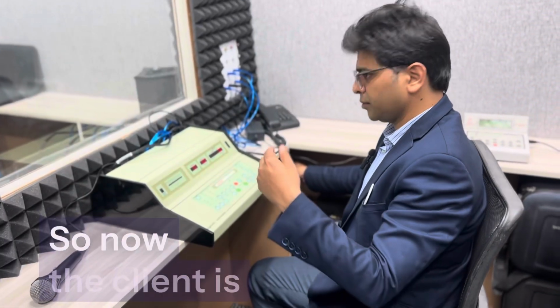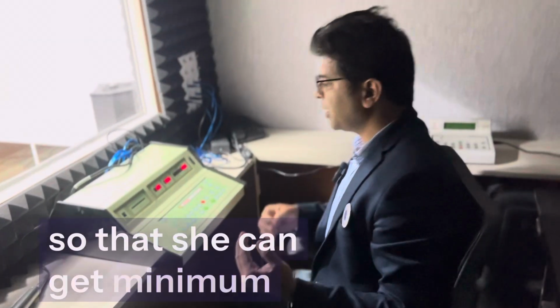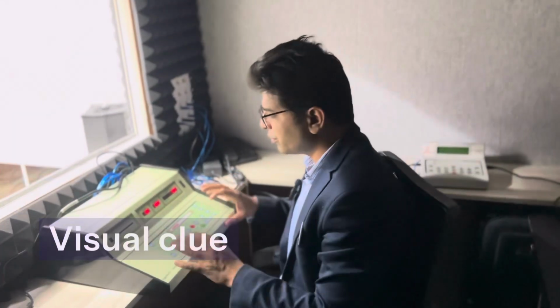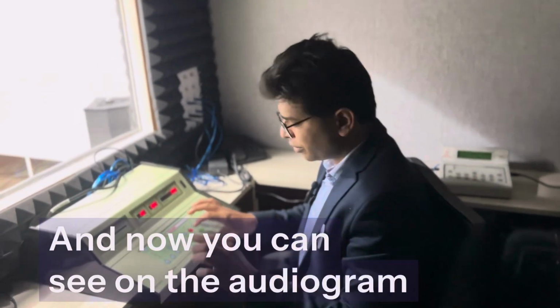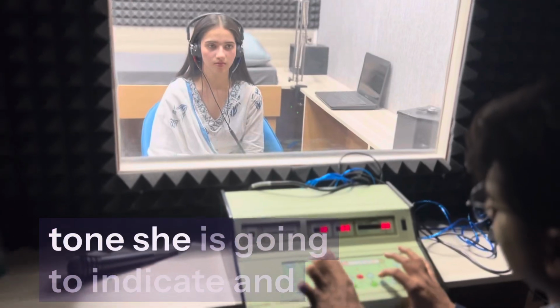So now the client is sitting in that other room. I'm going to turn off the light so that she gets minimum clues. And now you can see on the audiogram, I'm going to present her with the tone, and whenever she hears the tone, she is going to indicate.